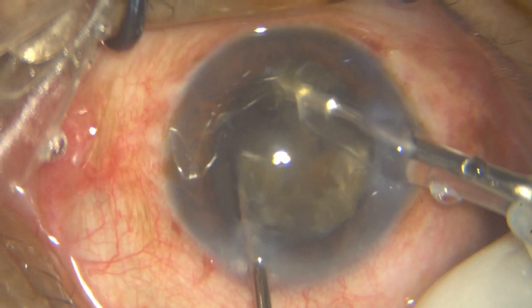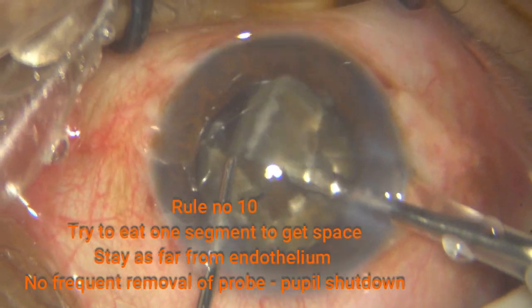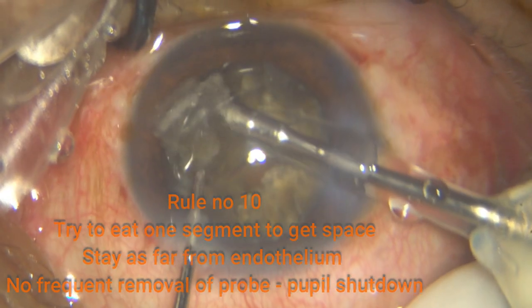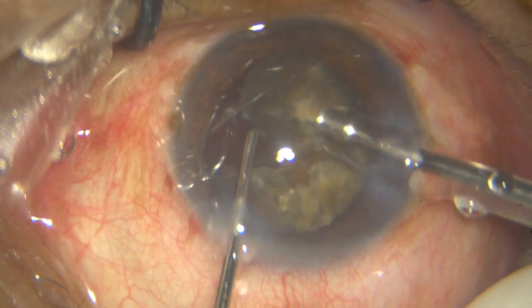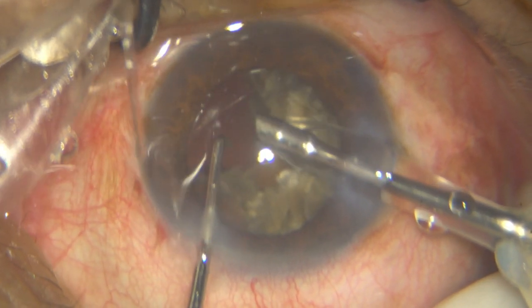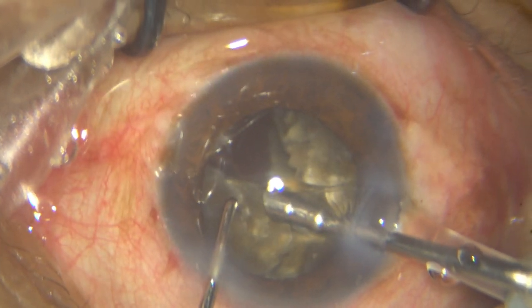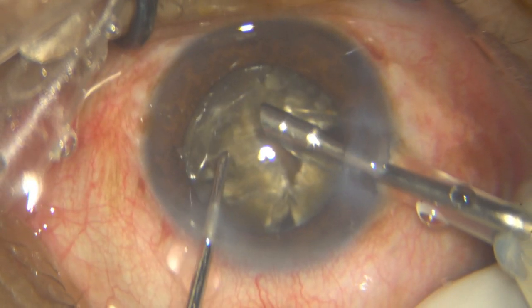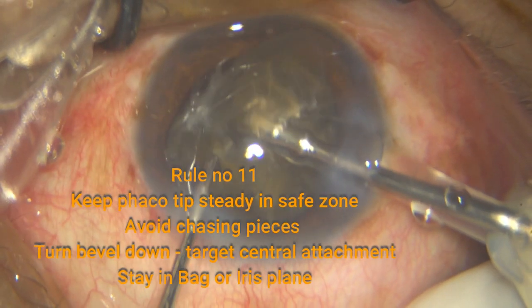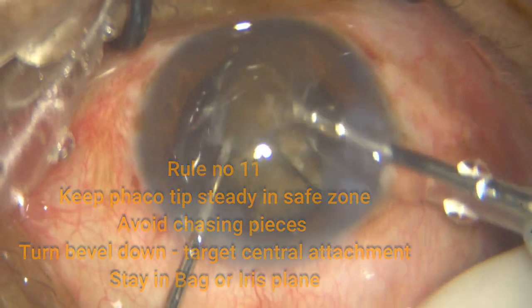Keep going, keep making segments, try to separate some of them if you can, and try to stay within the bag or at the most at the iris plane. Now here I am trying to target one segment. See, this is separated, and once I get that segment, I get enough space, and it's very easy now to get out the other segments. Although I have got very good chops, you can see there is still attachment in the center. Don't panic, don't bring it into the AC. Try to stay within the bag. Try to do it at the iris plane and avoid chasing pieces.